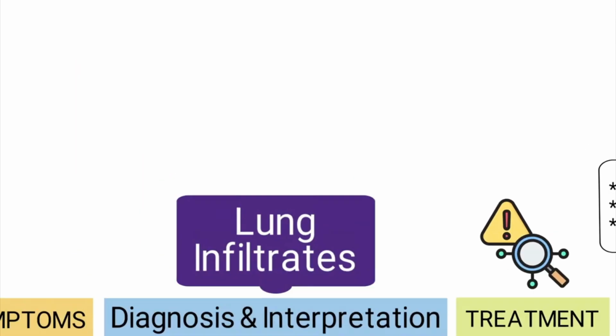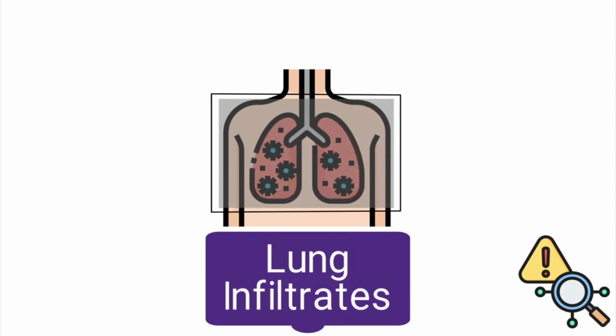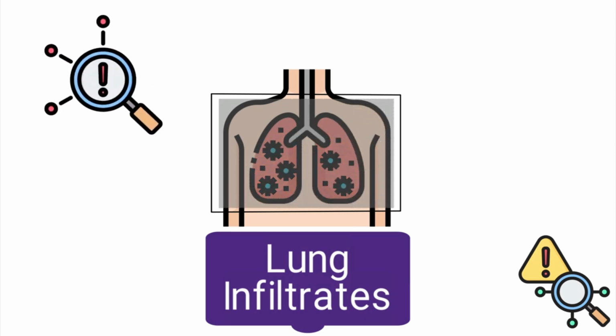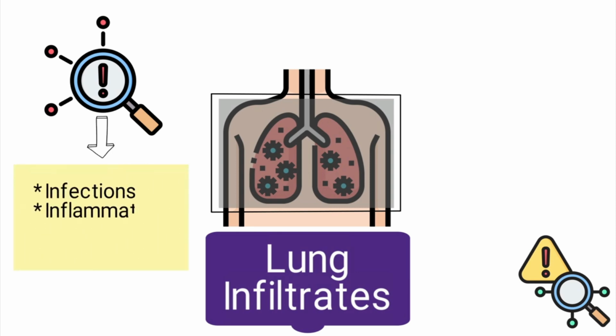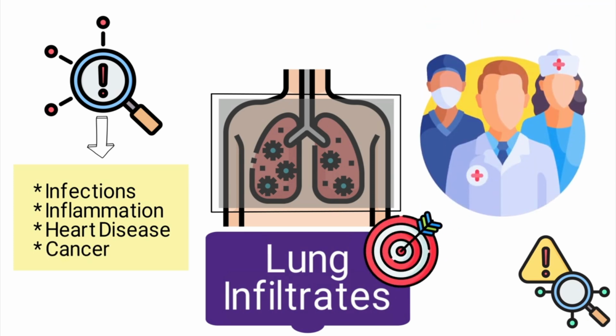But as previously mentioned, lung infiltrates are radiographic findings indicative of an abnormal presence of substances in the lung tissue. They can be caused by a wide range of conditions, from infections and inflammation to heart disease and cancer. Accurate diagnosis and treatment of the underlying cause are crucial for managing the condition effectively.